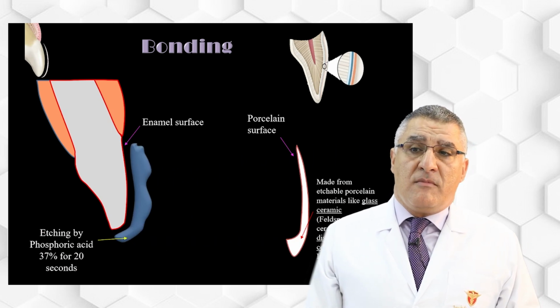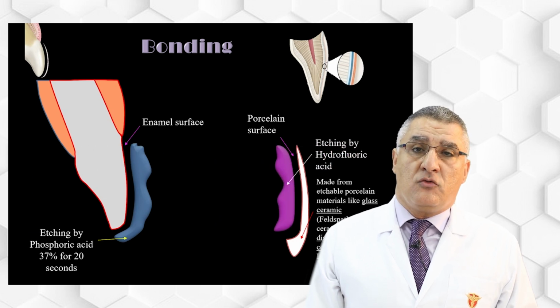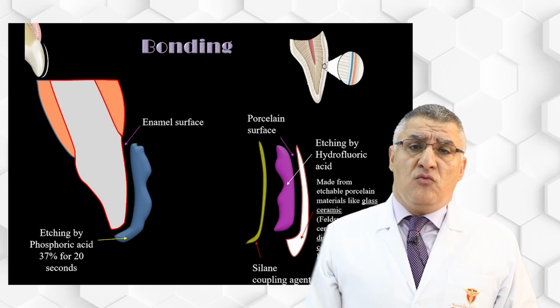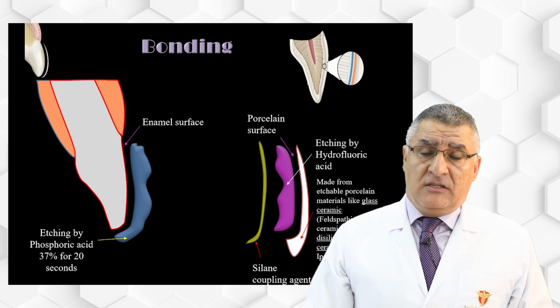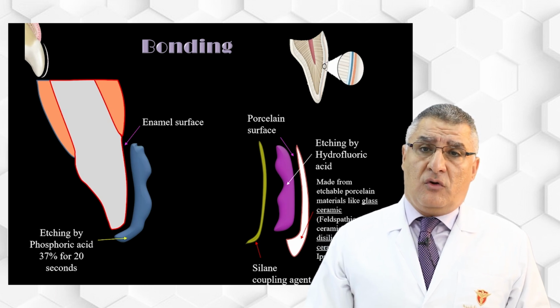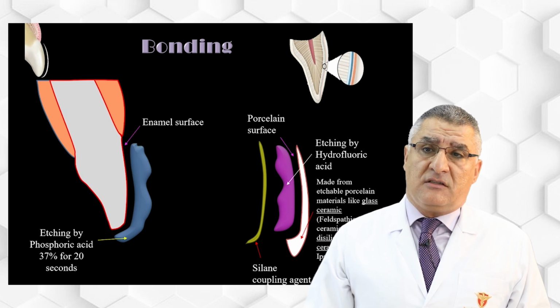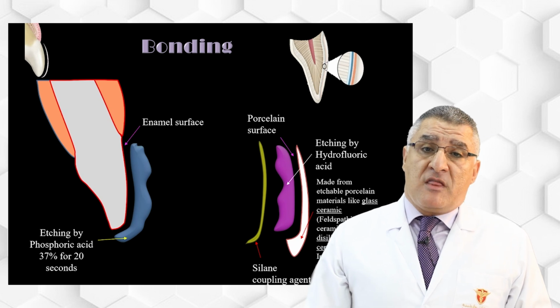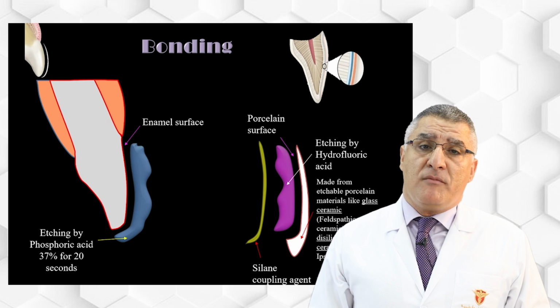For the tooth, we will make an etching by phosphoric acid. For the ceramic, we will do etching with hydrofluoric acid etch. Then we apply silane coupling agent for the ceramic. So for the ceramic surface, we have to do etching, hydrofluoric acid etch, and after that, rinsing and washing, application of the silane. So the mechanism of bonding in veneers involves two techniques: micromechanical bonding and chemical bonding.